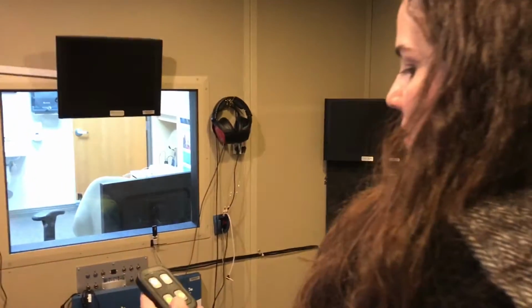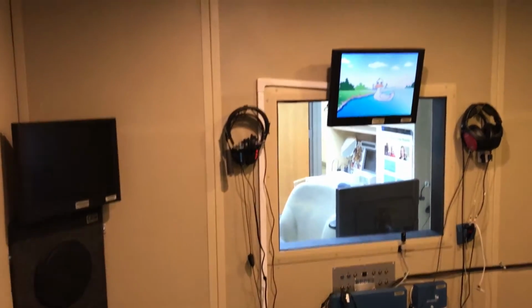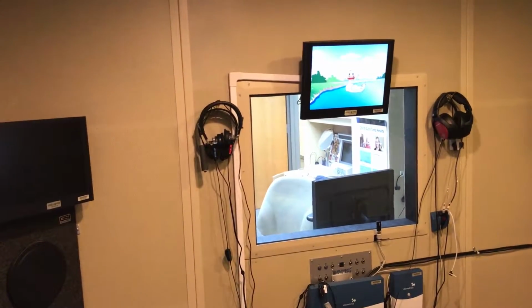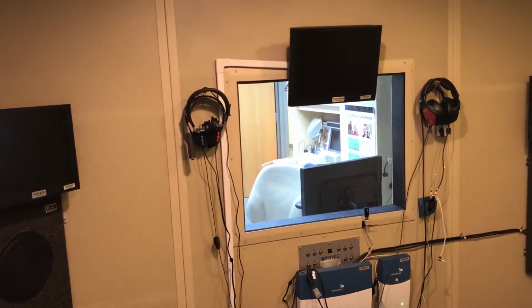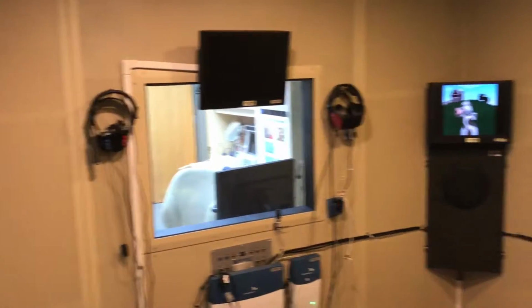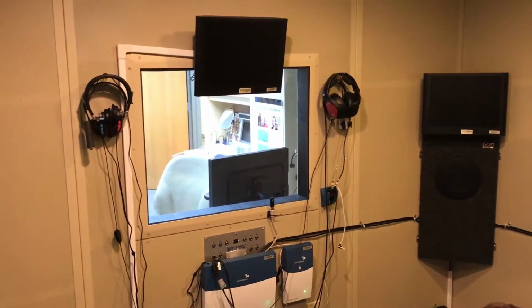When we conduct VRA testing, we present sounds out of the speaker. We localize using, this is video VRA, so we show the patient a cartoon to get them centered, and as they localize, we will reinforce that by playing a little cartoon on the monitor. So that's sound-field testing, or VRA.